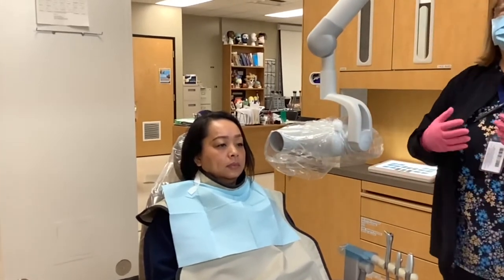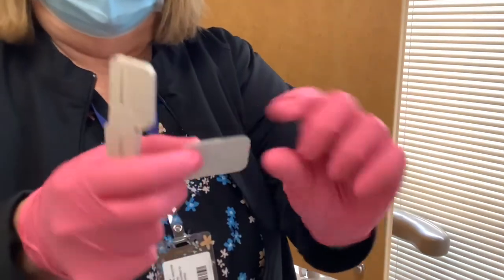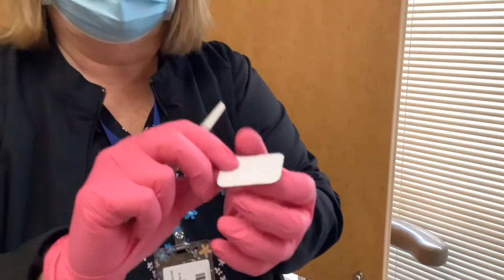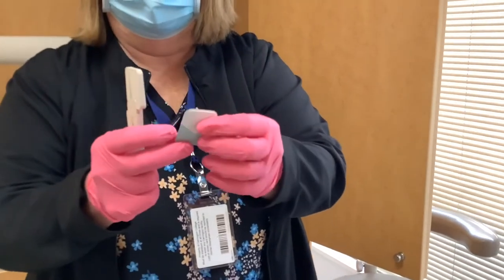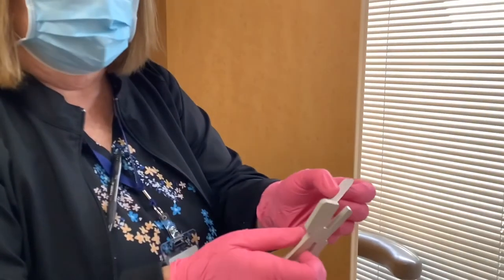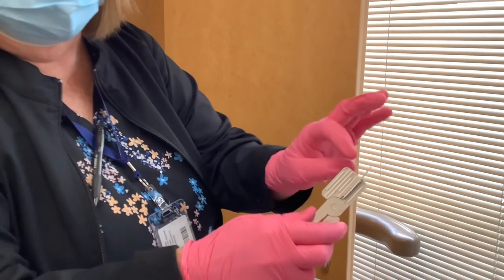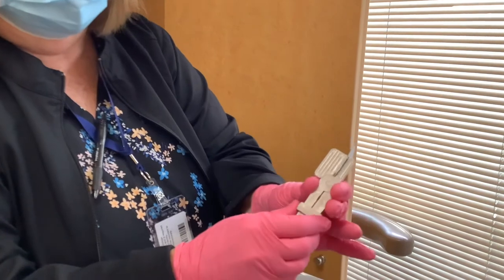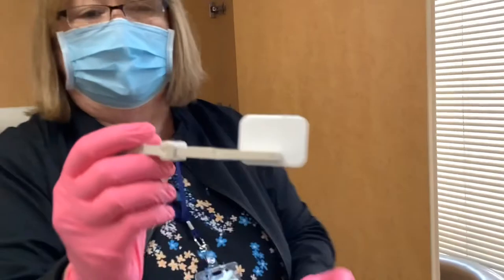There's an upside and a downside on the film. On the upside you'll see the dimple — we always want the dimple facing out, so make it a dimple, not a pimple. This is your snap array. When placing the film, we place the dimple towards us, putting it in the film holder. That's how the film holder will look.